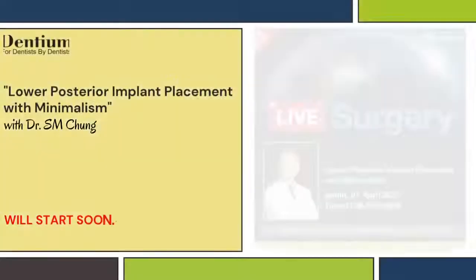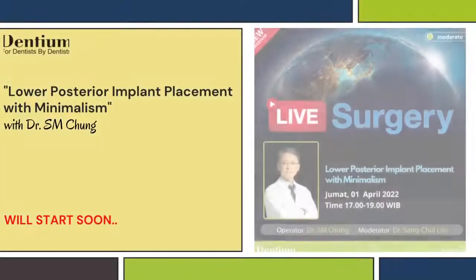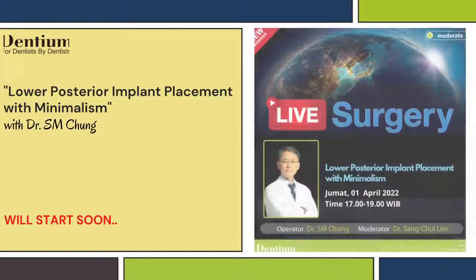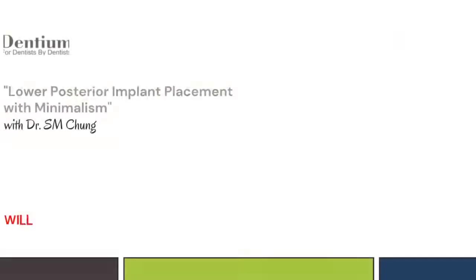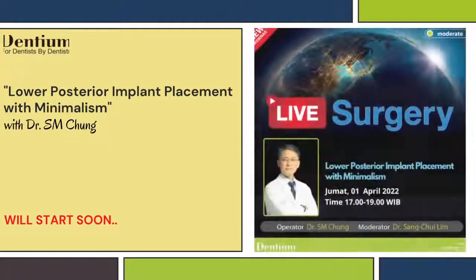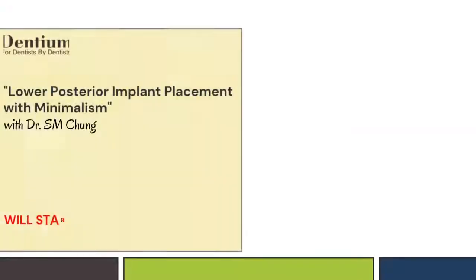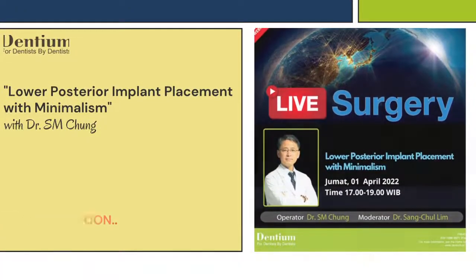So 3 implants on the right mandibular area and 2 implants inserted in the left mandibular area. Both of them are tissue level implant systems. Especially this tissue level implant system gives us strong primary stability when you have insertion, especially in softer bone.